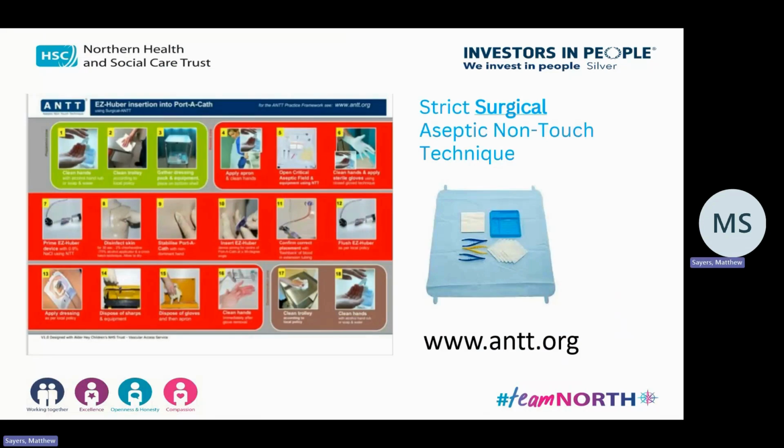There's a lot of discussion about the type of aseptic non-touch technique used for different types of access, but this one is definitely the strict surgical aseptic non-touch technique. If you're not familiar with it, this website here, which handily enough is www.antt.org, has every sort of scenario of what you would be doing and what type of ANTT you should be doing.